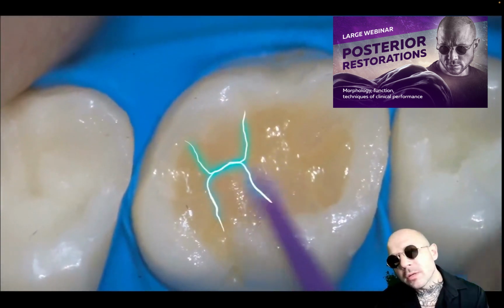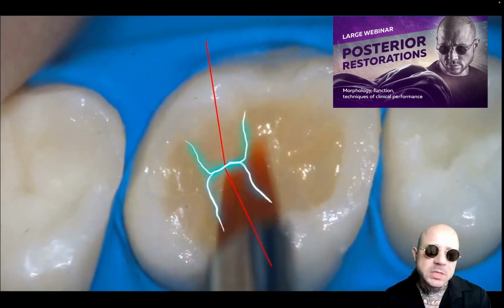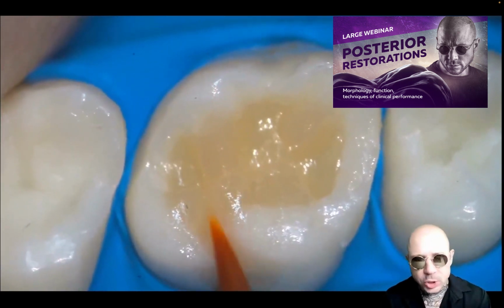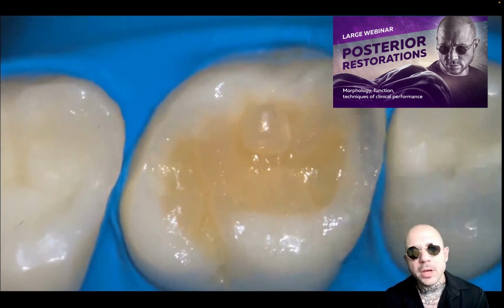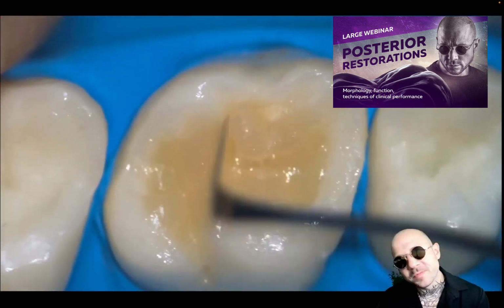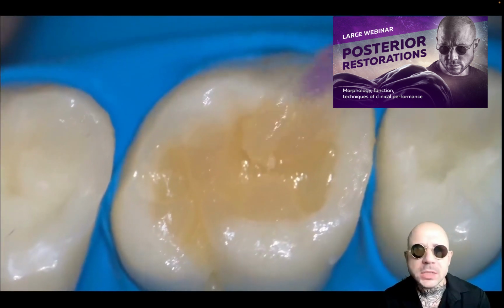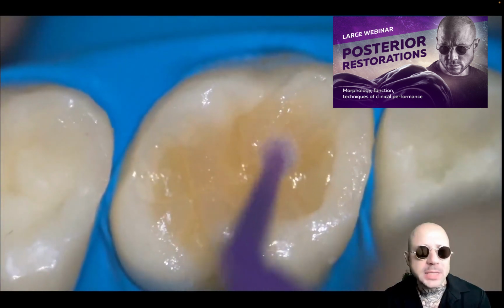Keep controlling ourselves in our action, and the sufficiency or excessiveness of volume, with the method of instrument I showed you. The process is more boring because the number of side ridges is two times bigger than the central ones. But generally, the essence of the actions is the same as for the central ridges.